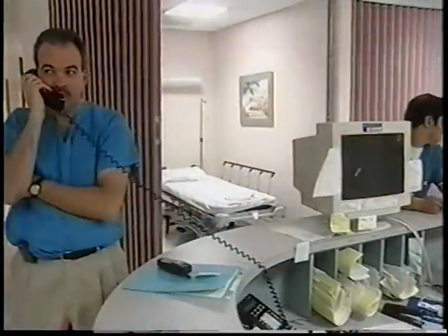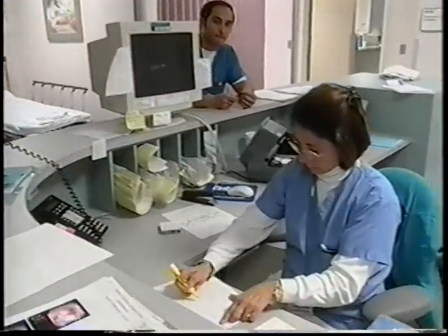As a gastroenterologist or as an endoscopist, many of us feel that once you put your PEG tube in place, your job's done. And in fact, your job's just beginning. As I explained to my colleagues, the PEG tube placement is the longest implant that an endoscopist puts in a patient. So the whole team plays a very, very big role here. Particularly in a patient with a PEG, the endoscopy nursing role is expanded because you may have a connection with the patient before and during and after the procedure, and you want to have them educated throughout the whole time.